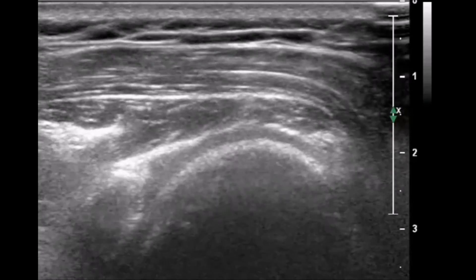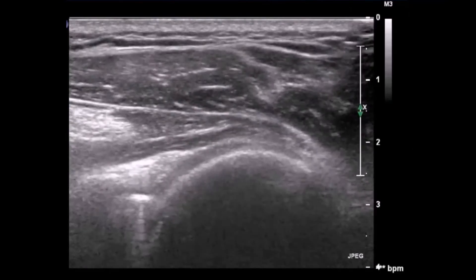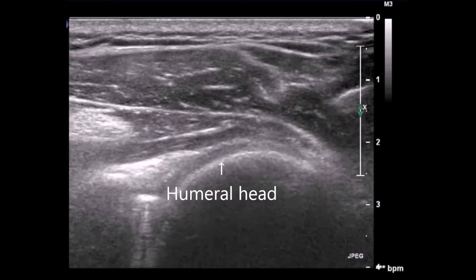The correct injection site requires that you must be able to view the glenoid labrum and the humeral head simultaneously on the ultrasound image.